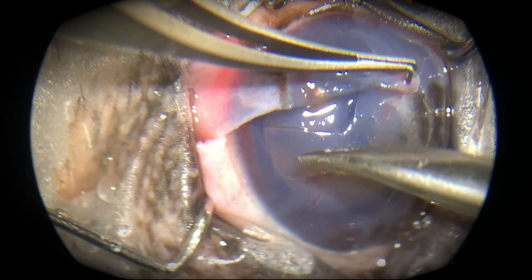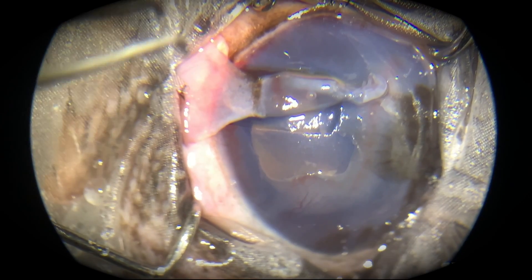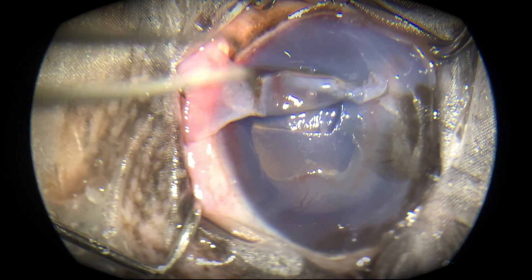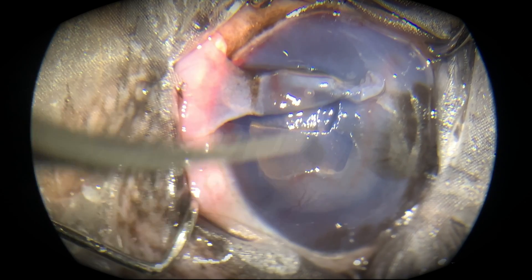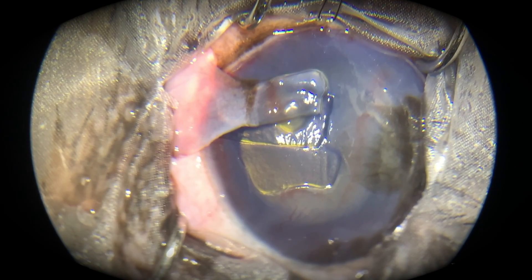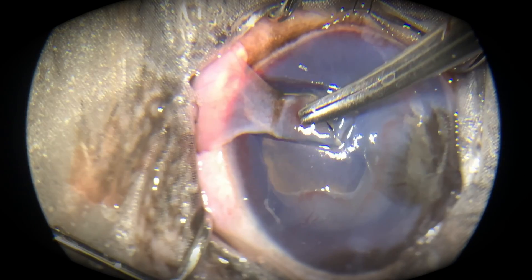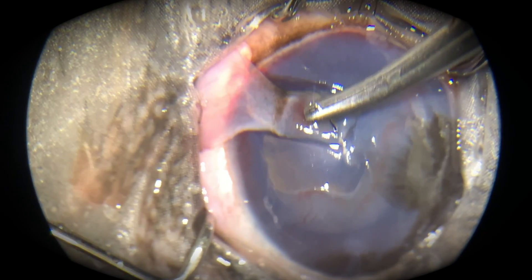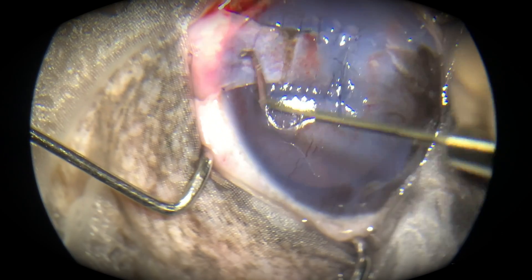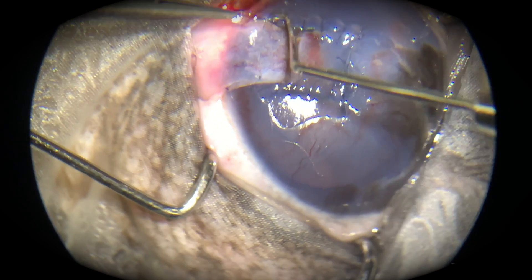The graft is now going to cover that hole. Some conjunctiva will come along with it, and even though it looks pink right now, it will become transparent after about one to two months — nobody will be able to tell a difference between this eye and the other one. The section with the corneal ulcer has been cut away, and this healthy corneal section, slid forward, will be stitched using 10-0 suture material.